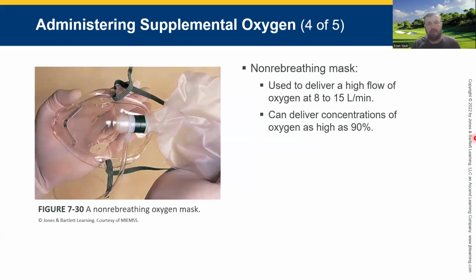This here's a non-rebreather mask used to deliver high flow oxygen at 8 to 15. My personal thing, I'm going to tell you that if you put a non-rebreather on, you're at 15.